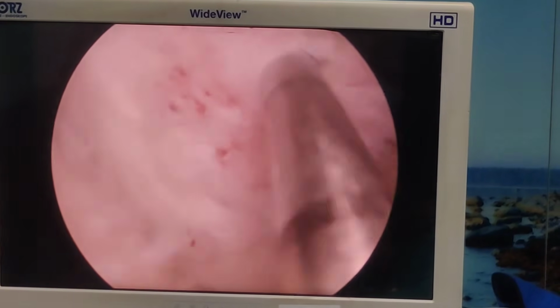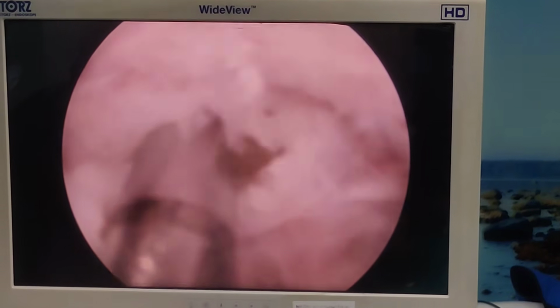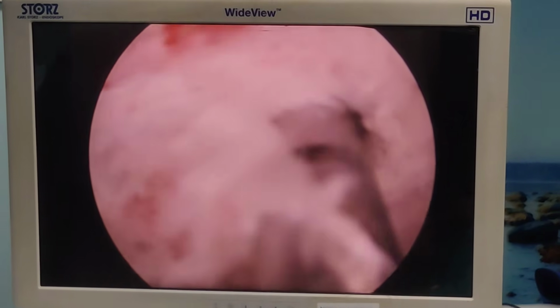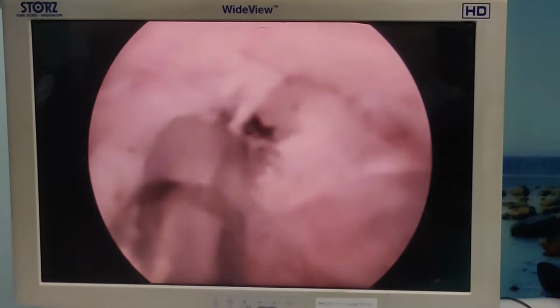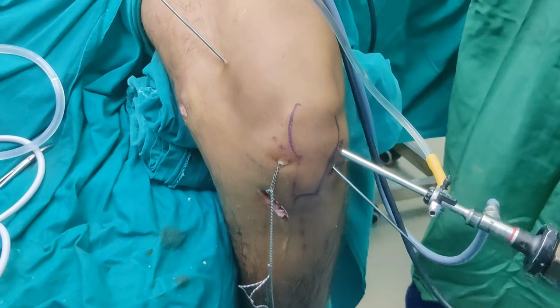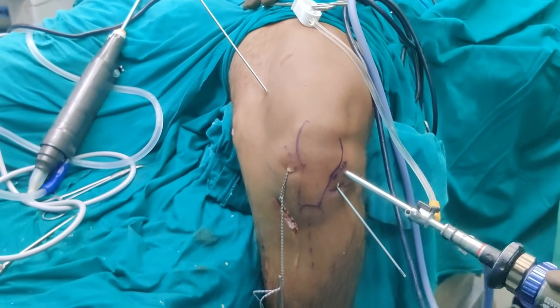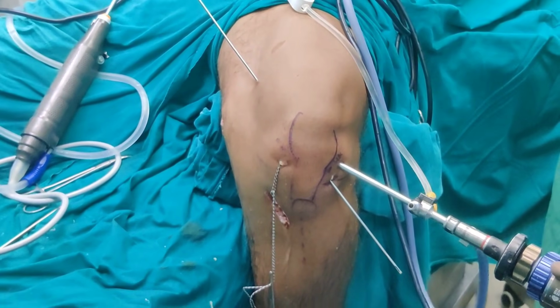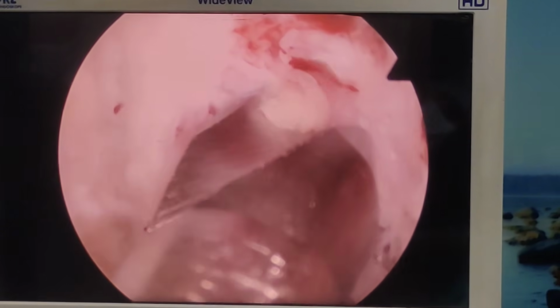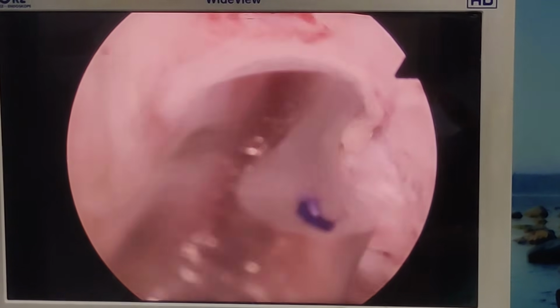So this is our beath pin gone. We are going to measure our tunnel length, and then depending on the tunnel length, we will use a loop endobutton, and then we will show you the next step. So if you are in the right space, this is where your beath pin will come out when you are making your femoral tunnel. You can see that our drill is very close to the articular surface and very high. So this is where the anterolateral bundle is. So we are going to drill with our 8 mm drill. Come on Manish, go.